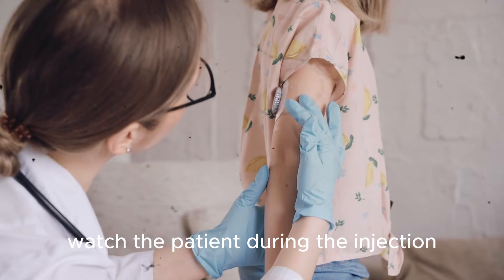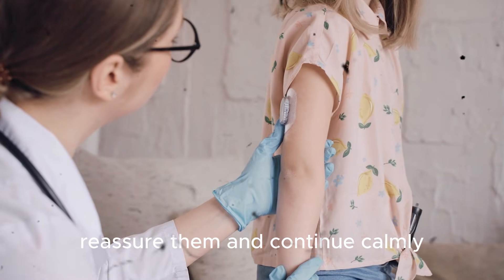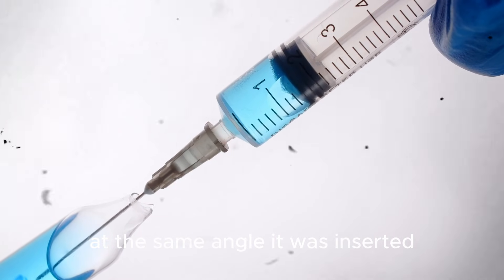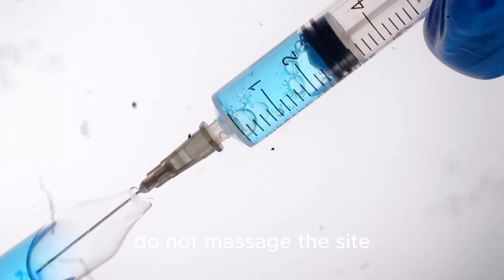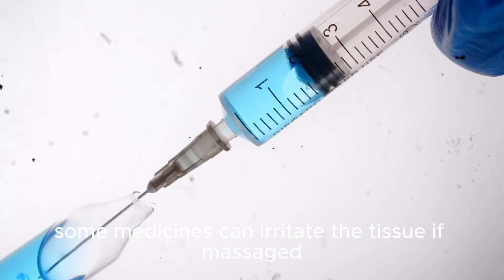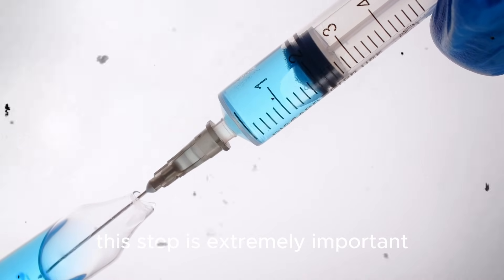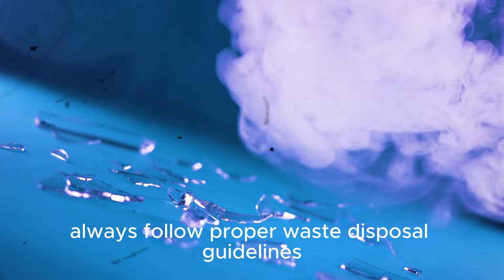Watch the patient during the injection — some patients may feel discomfort or anxiety, so reassure them and continue calmly. Once the medicine is fully injected, wait briefly before withdrawing the needle. Withdraw the needle smoothly at the same angle it was inserted and apply gentle pressure with a clean cotton or gauze. Do not massage the site unless specifically instructed, as some medicines can irritate the tissue if massaged. Dispose of the used needle and syringe immediately into a sharps container. Never recap the needle, as this is extremely important to prevent needlestick injuries and the spread of infection. Always follow proper waste disposal guidelines.